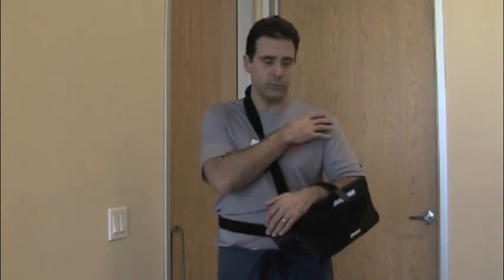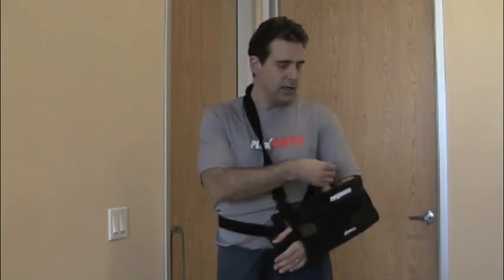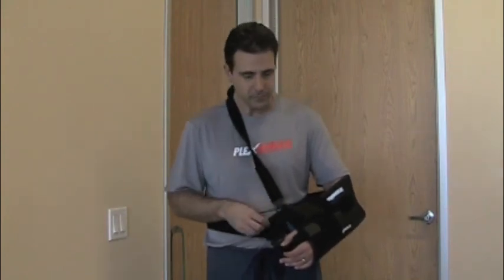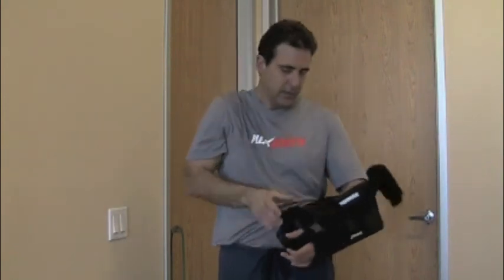This shoulder is pretty much, for all intents and purposes, supposed to stay in this sling day and night. Okay? So just make sure you wear this at all times initially for the first few weeks until you start your program for physical therapy with your surgeon. That being said, when you take off this sling, it's just a matter of unsnapping a couple clips here, and then the sling's off, and then you take the pillow and you slide it off. Okay?